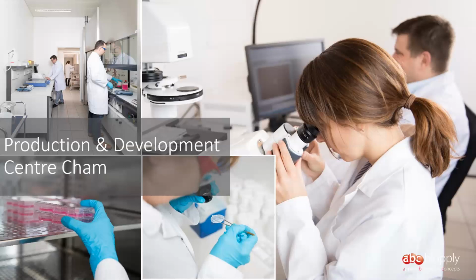So even though they do not round up, they still aggregate with each other and form compact cell-to-cell connections, which makes it possible then to harvest those cones from 3D CoSeedis. However, when they are harvested, they still look like cones. So they're not really rounding up. We have so far never transferred those cones into, for example, low attachment plates and continued to grow them to see how they would behave later on. All we have done is plate them in normal dishes, and then of course they show similar behavior as spheroids. They start attaching to those dishes and cells start to migrate out of the construct of the aggregate and grow in 2D.